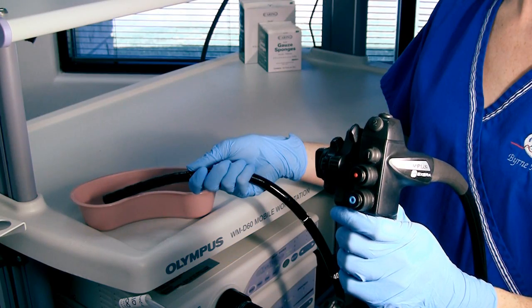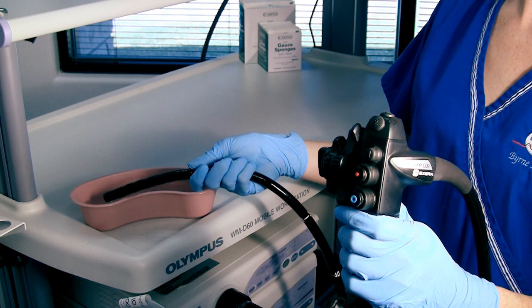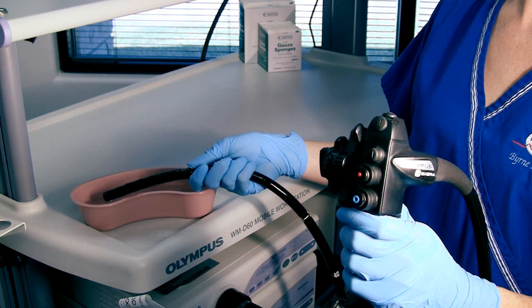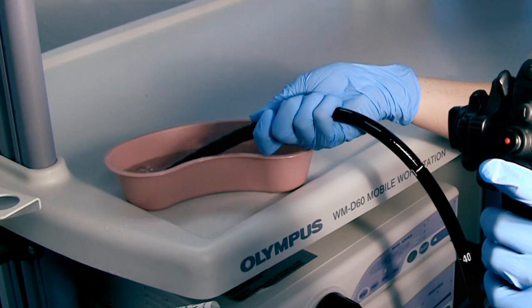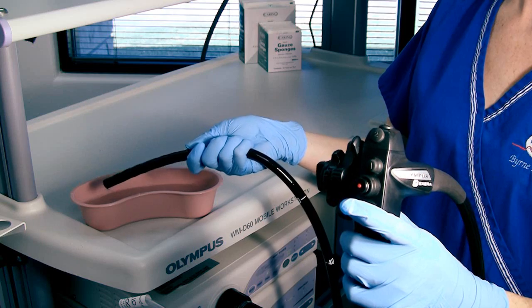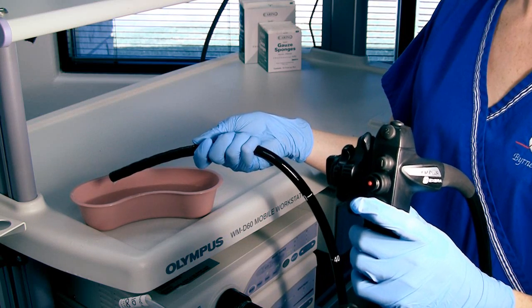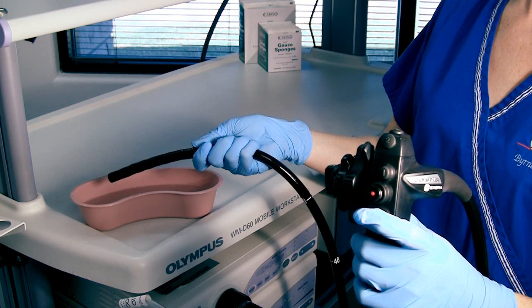After you have connected the Smart Cap to the scope, you will need to take the scope to do a quick test. Take the water basin filled with water and submerge the distal tip of the scope. First, cover the air button with your finger and check for bubbles in the water — if bubbles are present, everything is working properly. Next, bring the tip of the scope out of the water and depress the water button. After a few seconds, you should see a small stream of water running across the lens.